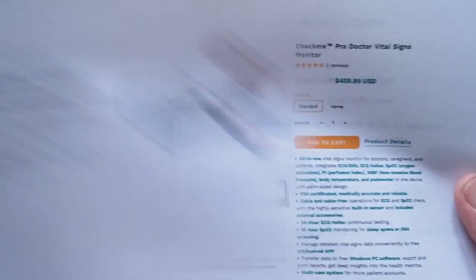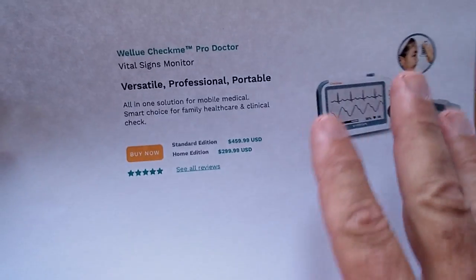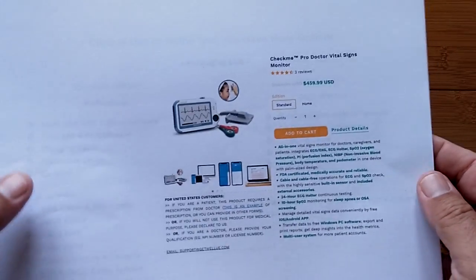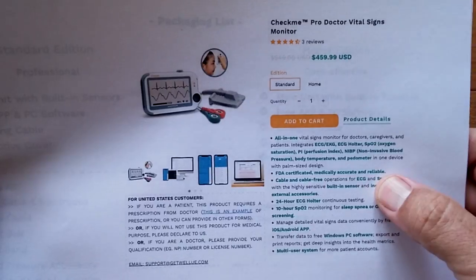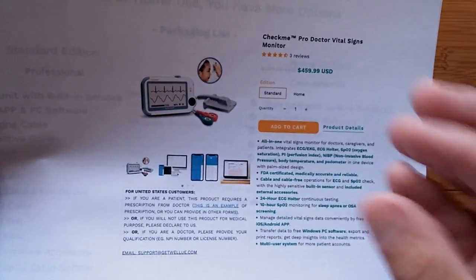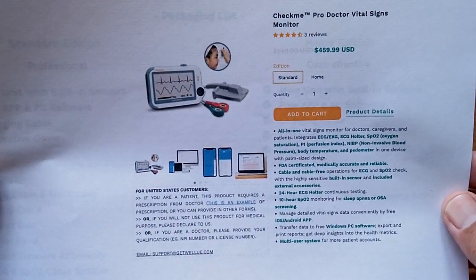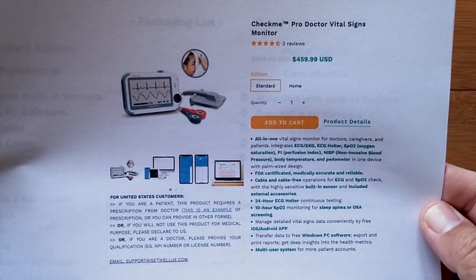There are two different versions: a standard edition, which is very technical, and a home edition, which is more affordable and consists of the main unit with all the capabilities it can do on its own. This is really designed for doctors and medical professionals. It's FDA certified and has gone through all sorts of different approvals, which contributes to the price. For U.S. consumers, you'll need a doctor's prescription to order it, but healthcare providers can order it directly from the website.